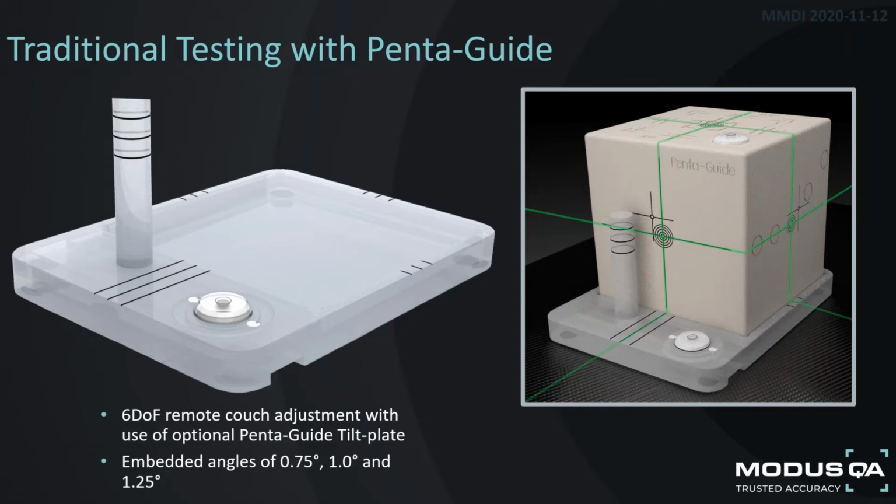And you can simply alter the position and rotations by using a different starting location or by simply rotating the setup by 90 or 180 degrees. So by obtaining a cone beam of the setup, you can perform a 3D image match of the Phantom, apply those translations and rotations with your 6-degree of freedom couch, and then you can verify that those adjustments were performed as expected.